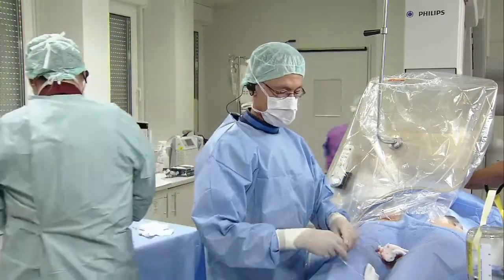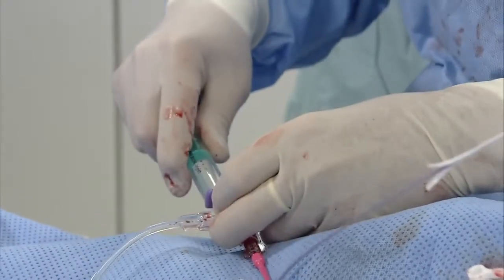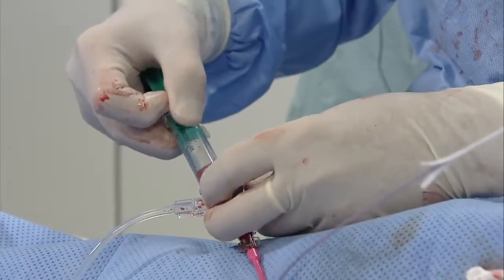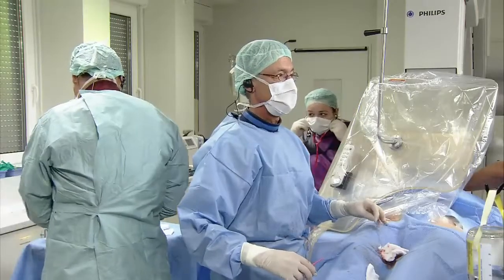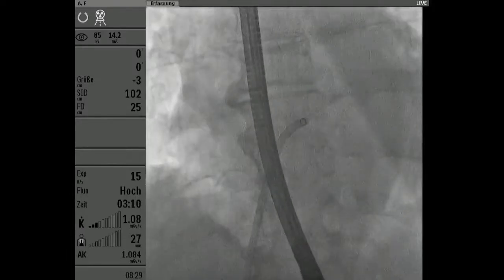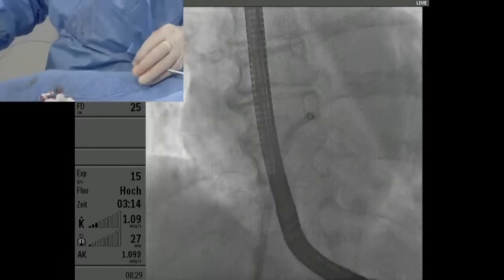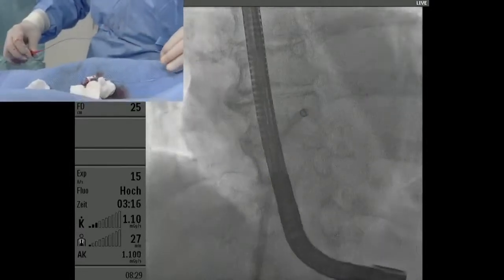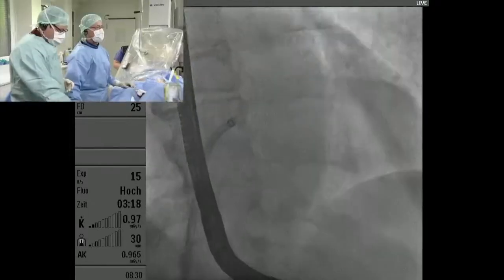Do you also have an arterial access, Horst? No. We never do this routinely. Peter, do you? Usually I do, and I put in a right coronary artery catheter just for having pressure control. And if there is a problem like that, it's a quick way to go for the right coronary artery, where air usually goes in if there is an air embolism.